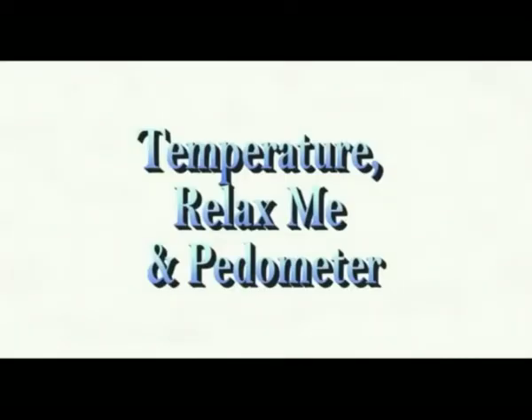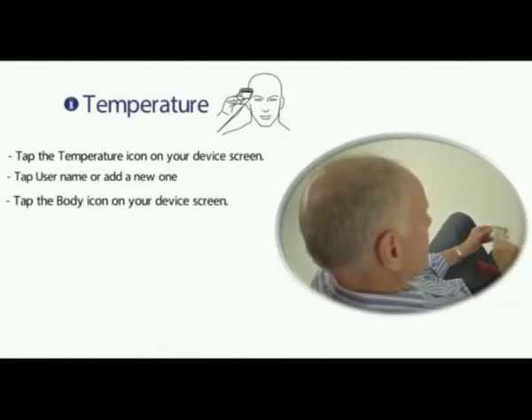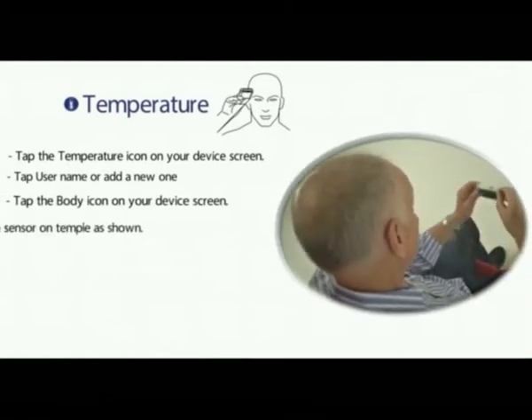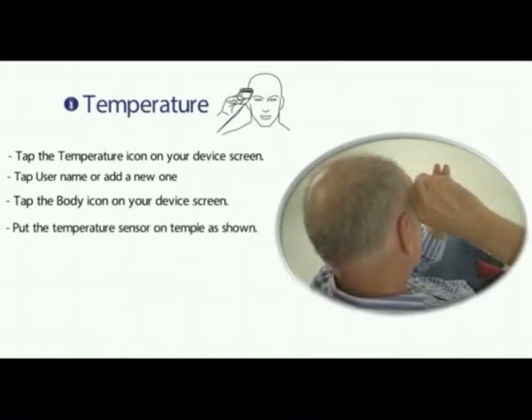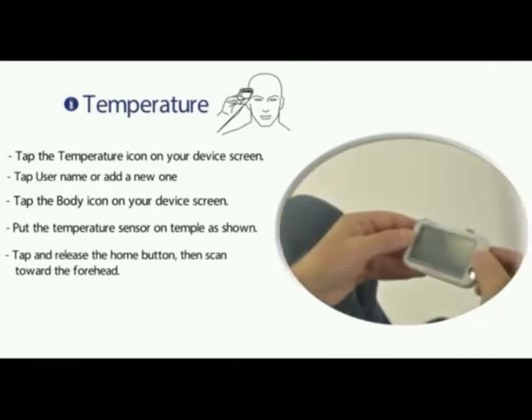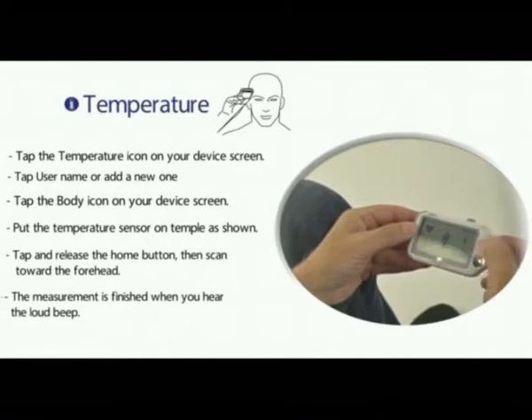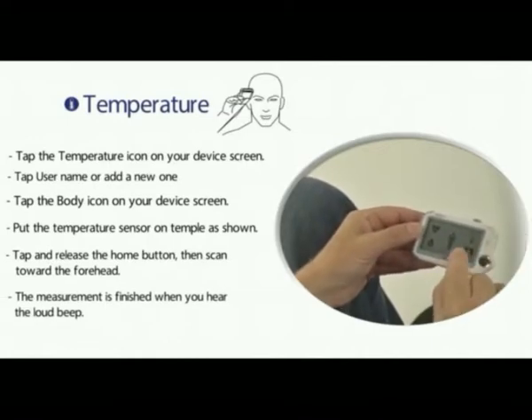Temperature, relax me, and pedometer. Temperature: tap the temperature icon on your device screen. Tap the user name or add a new one. Tap the body icon on your device screen. Put the temperature sensor on your temple as shown. Tap and release the home button, then scan toward the forehead. The measurement is finished when you hear a loud beep.